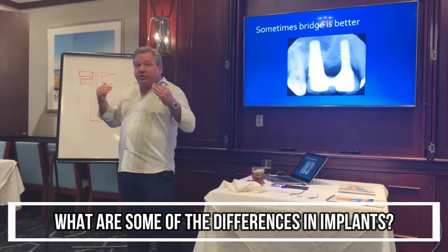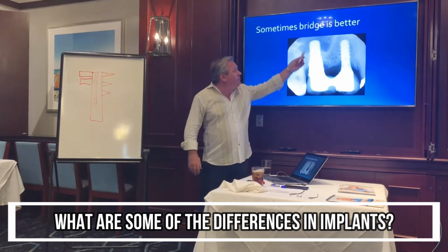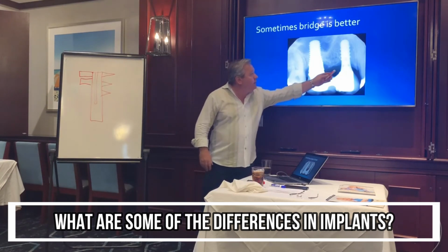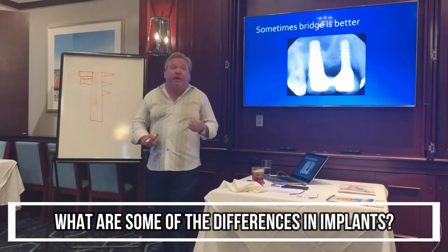And this kind of shows you that the upper jawbone is soft. The upper back tooth area has the softest bone. It takes the most bite force. So in a scenario like this, I like this implant because it's big enough and it has a bunch of threads. This implant you can see is smooth and has one, two, three, four very, very small threads. So I don't like that implant in that area.